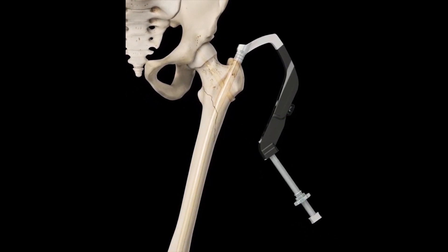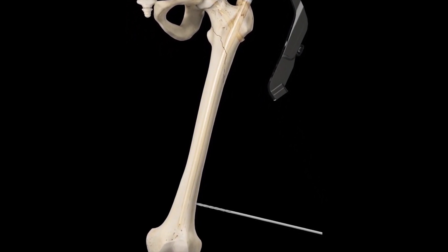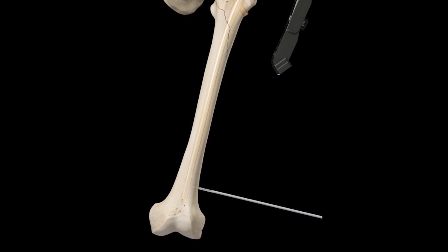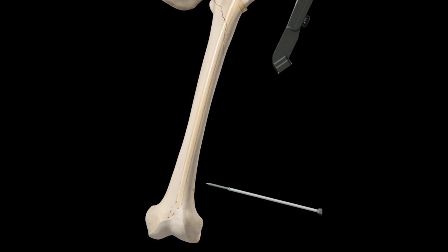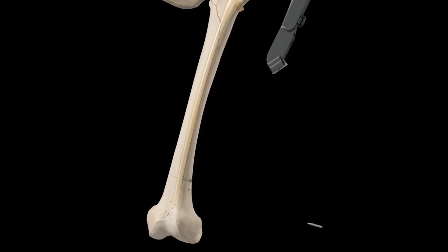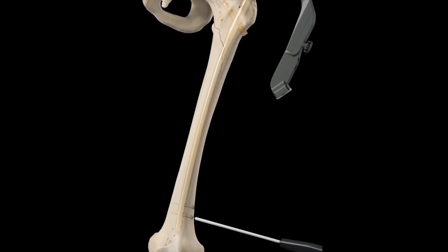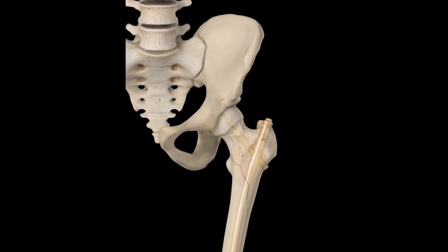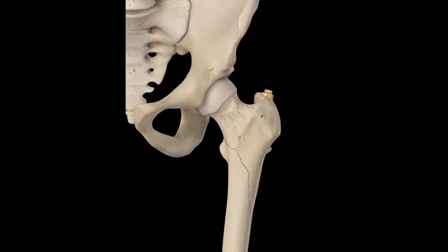A locking bolt corresponding to a hole at the distal end of the nail is drilled into the femoral shaft to ensure that the device does not shift inside the medullary cavity. The insertion device is then removed and an end cap inserted into the nail before the bone is left to heal.